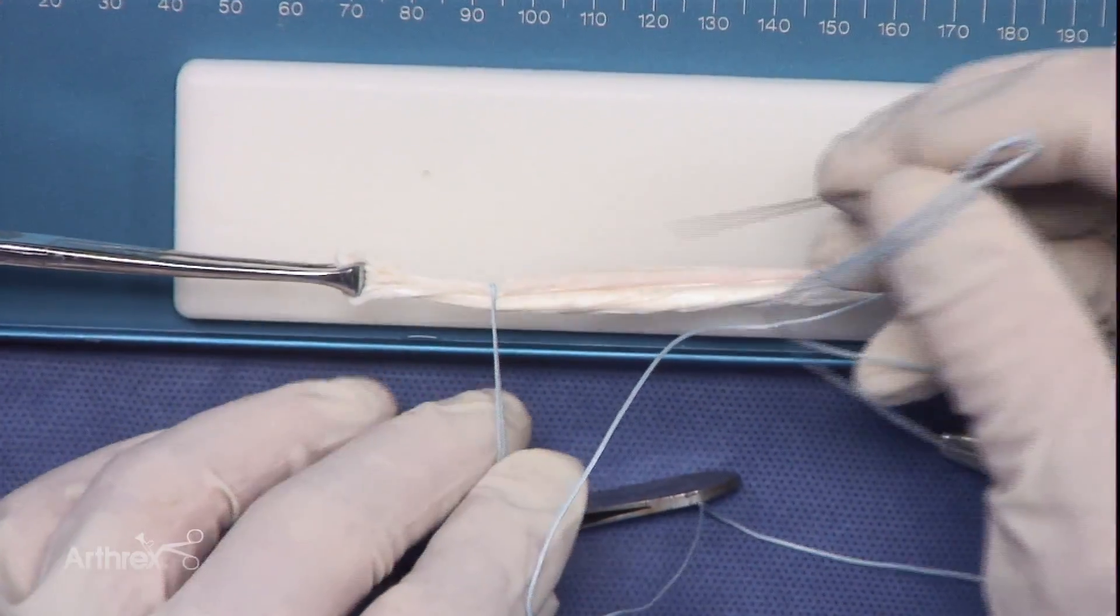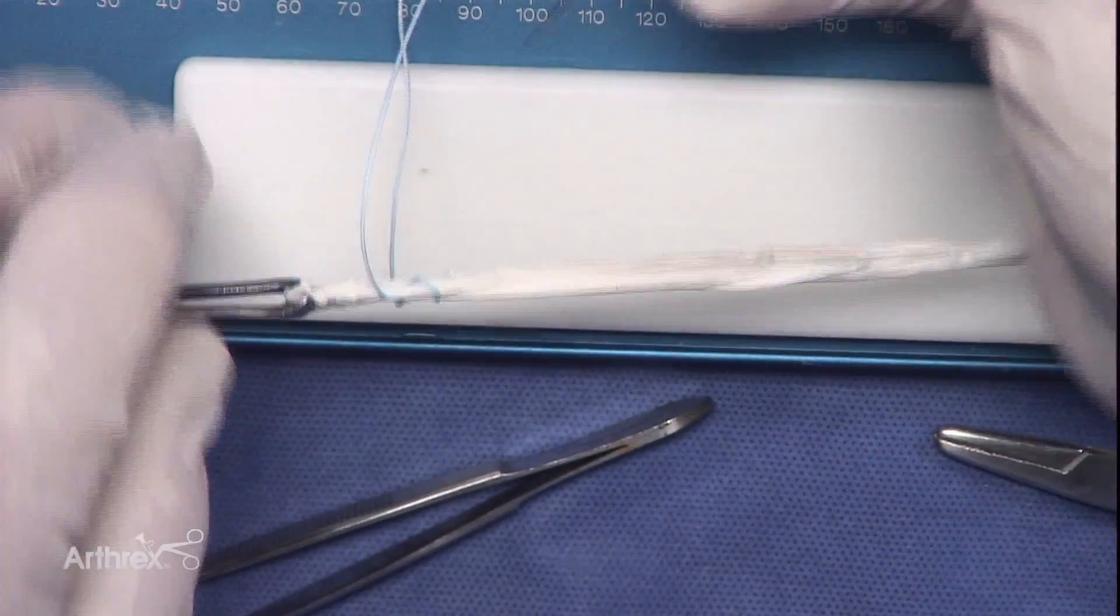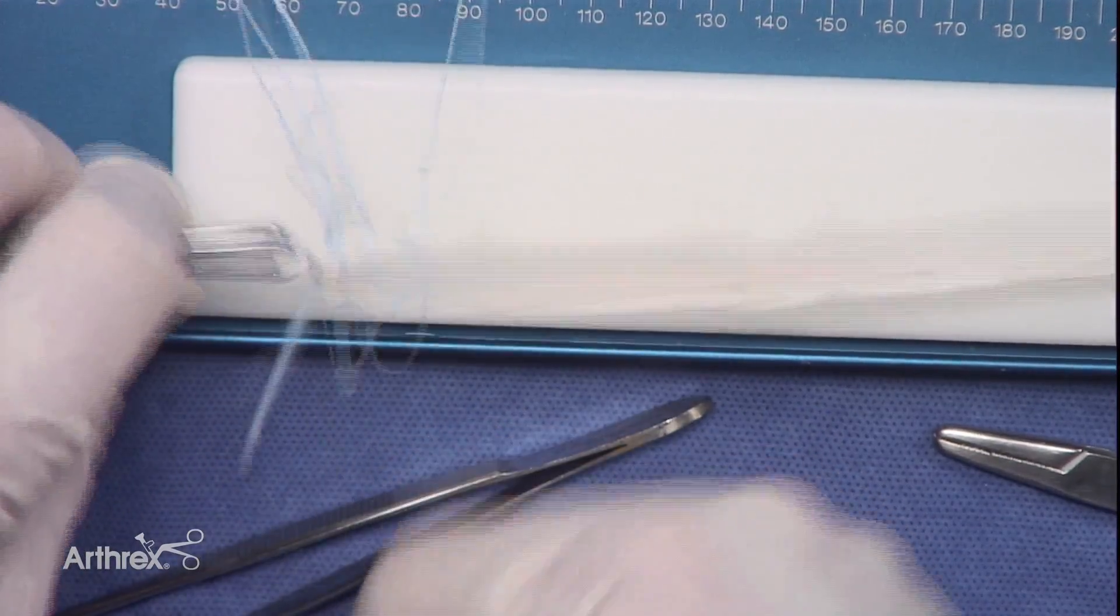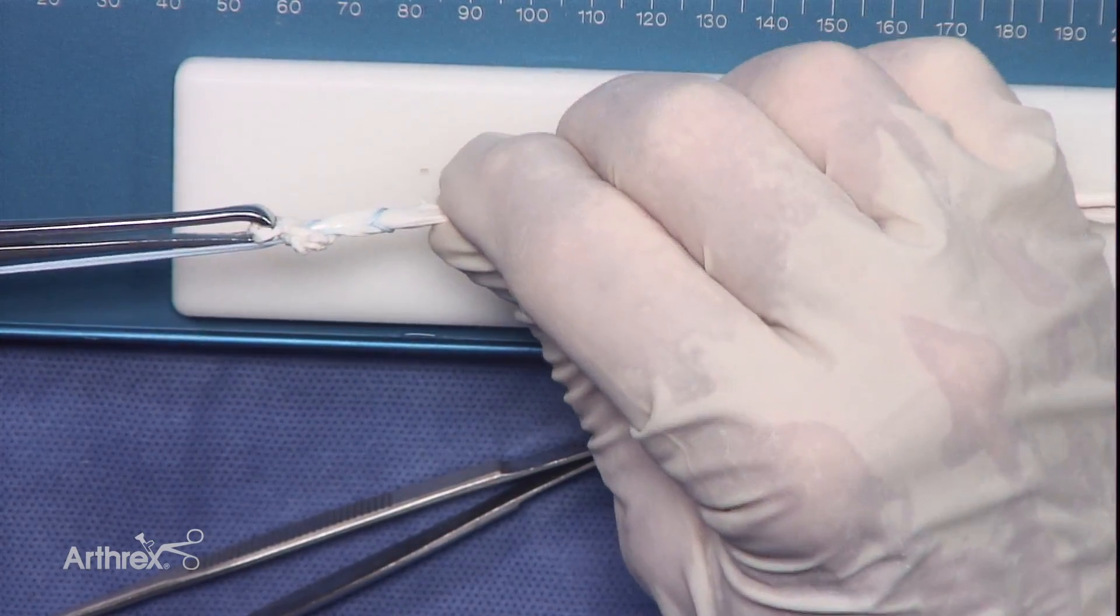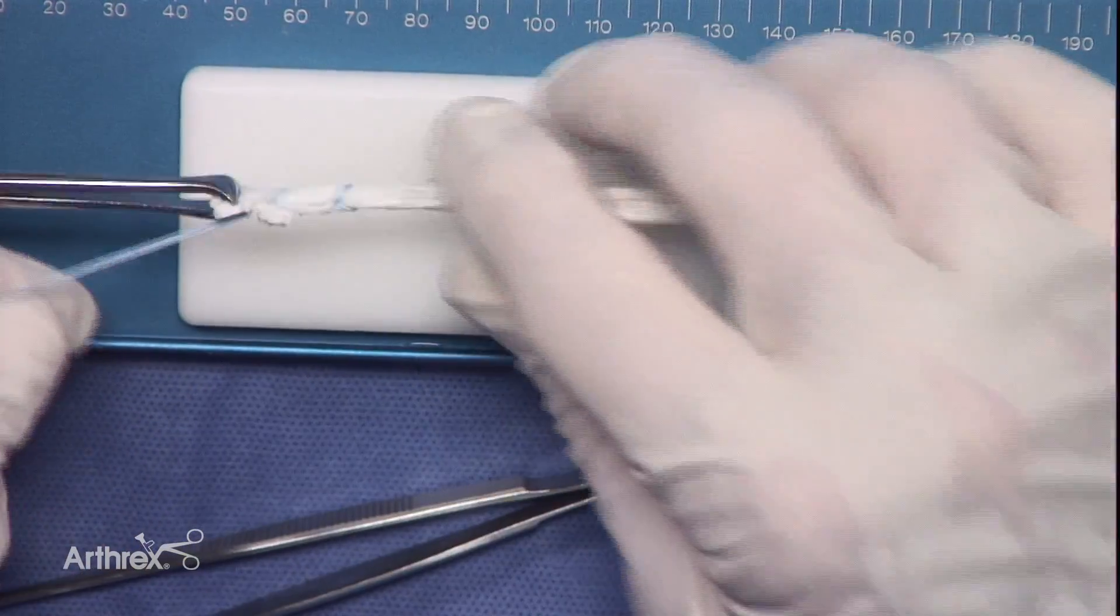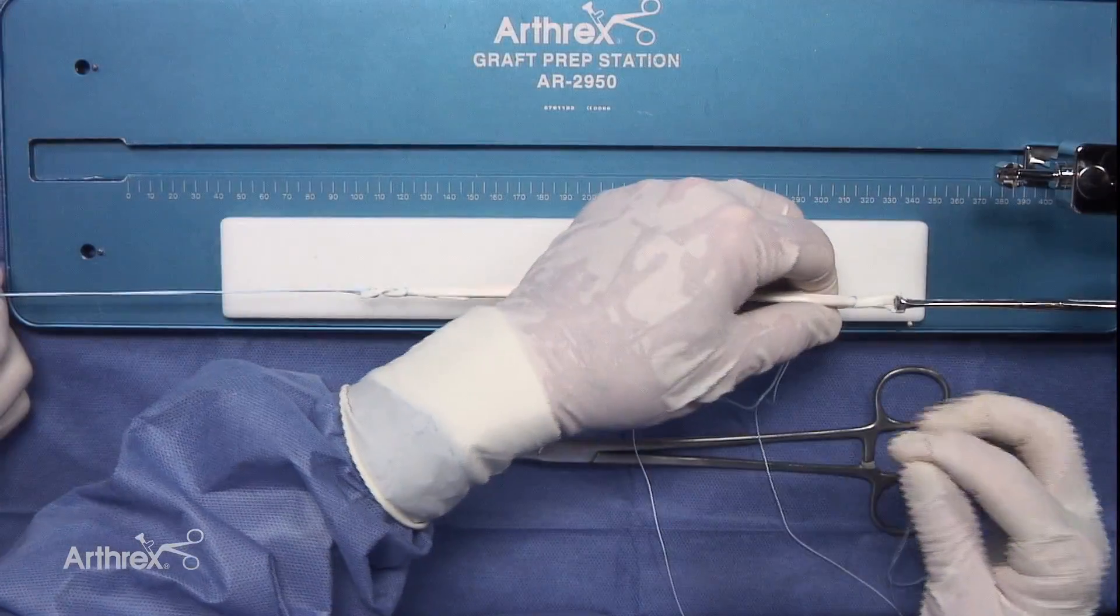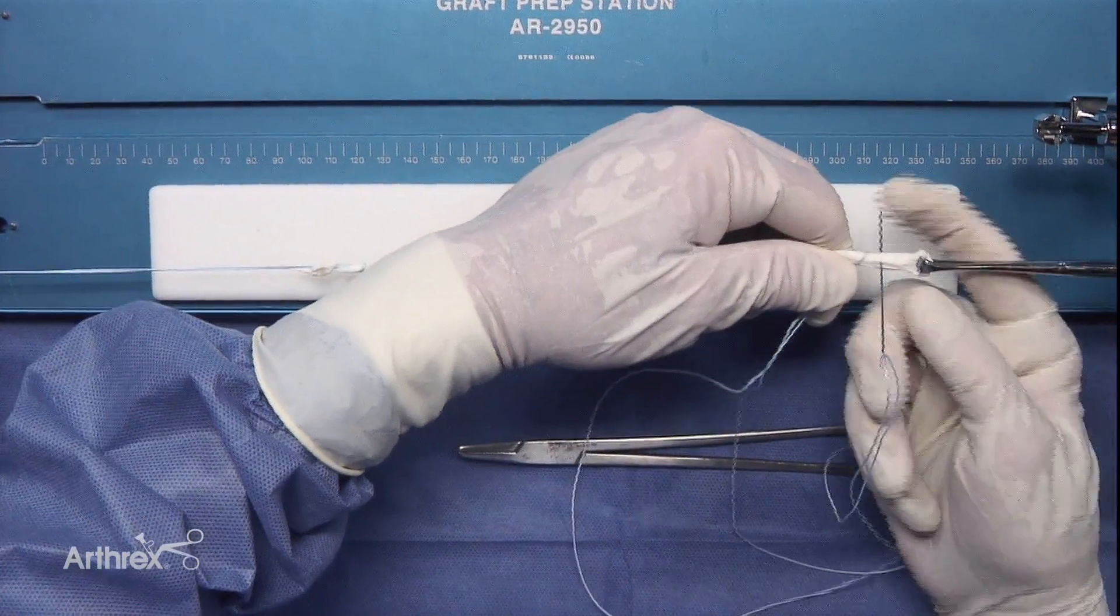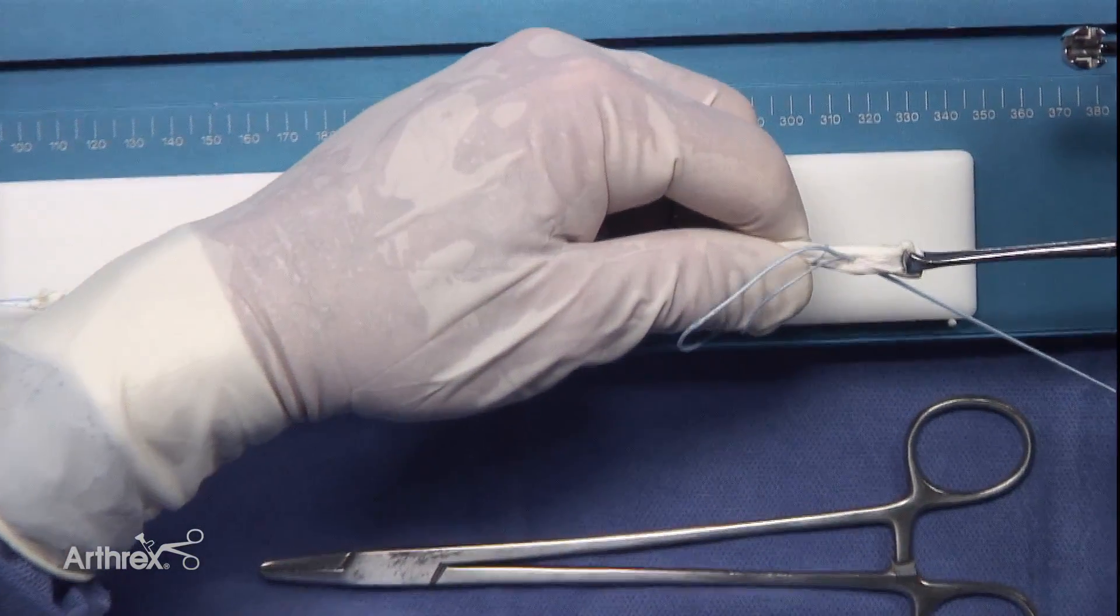We have a fiber loop suture approximately 25 millimeters from the end. We're going to pass the fiber loop one more time, and just grab the end of the graft. Those are two very simple fiber loop sutures that stabilize the end. We're passing the second fiber loop through the end, and this is a number two, and certainly for smaller tendons you can consider a zero fiber loop.